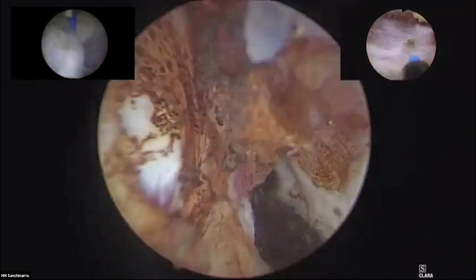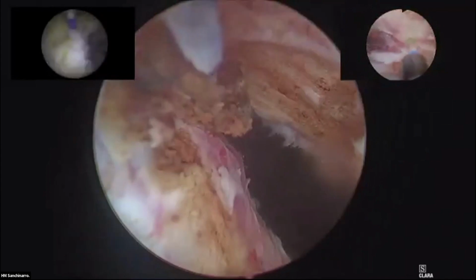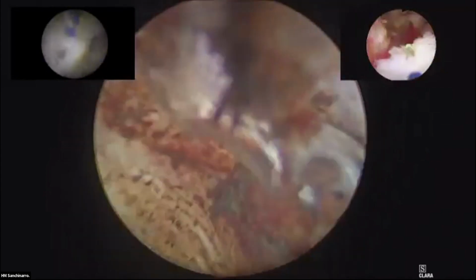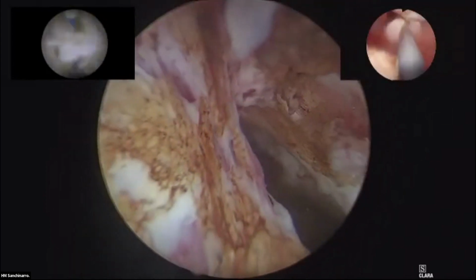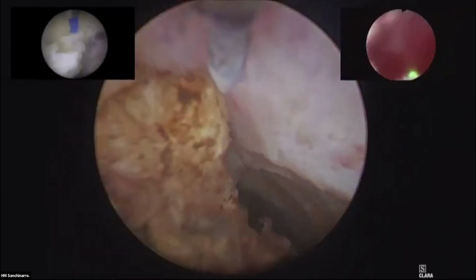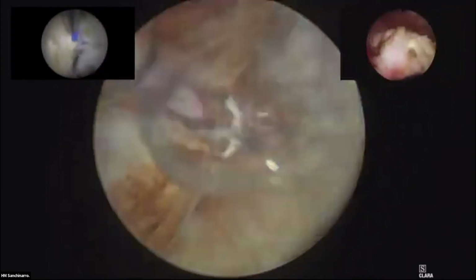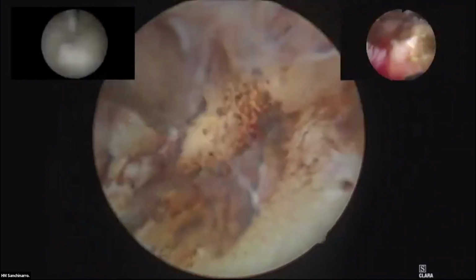I was quite convinced that it was better to start with thulium, but actually there are a lot of people that start with holmium and shift to thulium with no problem. The correct approach is to start with an energy that you can rely on, and then adapt your technique to the other energy, and that's it. I think this could be the key point.